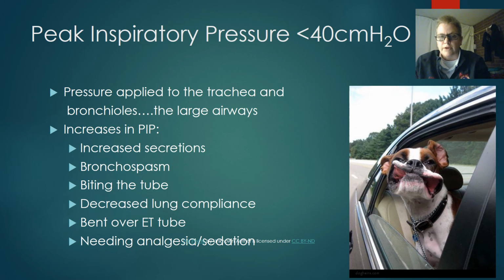So we want to make sure, if we have high PIPs over that 40, you need to look at this stuff. Do I need to suction? Do I need to give more bronchodilators? Are they fighting? Are they biting? If that was me and I'm out of control and I can't breathe right, this machine's breathing for me, it will be very uncomfortable. So please, if you intubate me, give me lots of pain control and sedation, okay? All right.